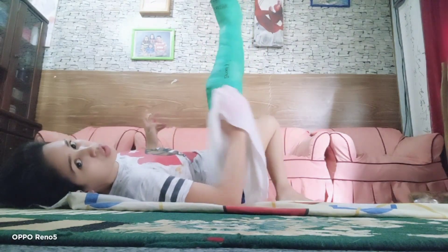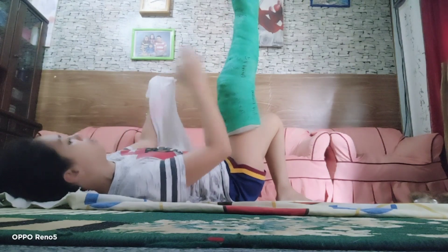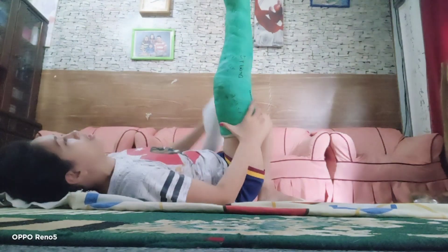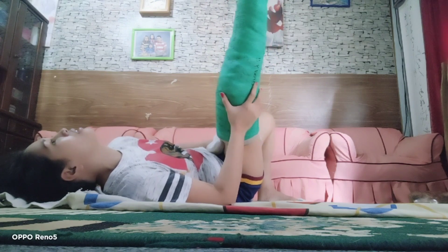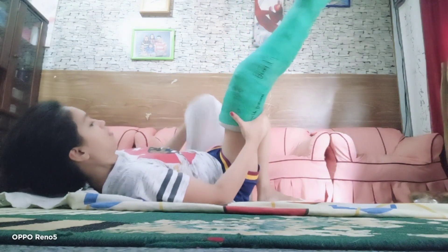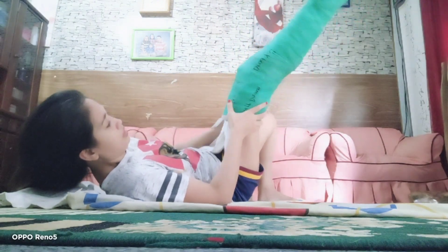Maybe some of you watching are always changing your cast, but me — it's almost three months that I've been wearing this cast. So that's how I clean it, and it's fine.